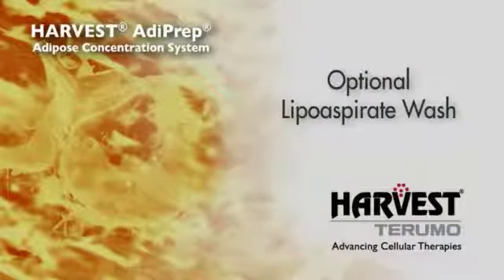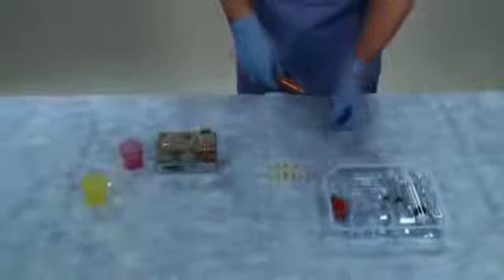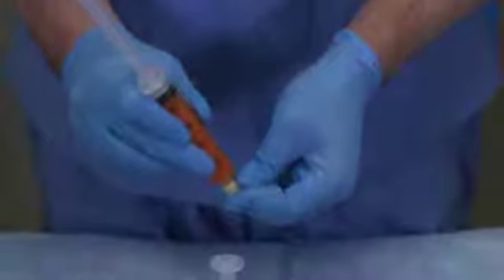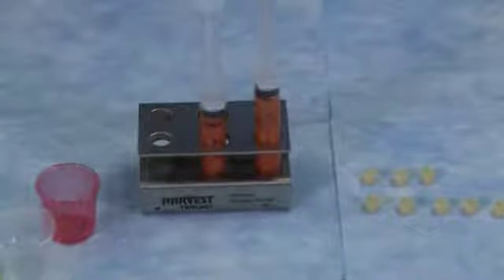An optional wash may be performed in cases where lipoaspirate samples contain significant blood content. This step will help further purify the adipose sample by removing red blood cells and other blood components. After filling collection syringes with lipoaspirate, replace the cannula with the tip cap on the end of each syringe. With the tip cap facing down, place each syringe vertically into a decant rack. Allow the lipoaspirate to stand for at least 1 minute. The infranatant fluid will settle to the bottom of the syringe.